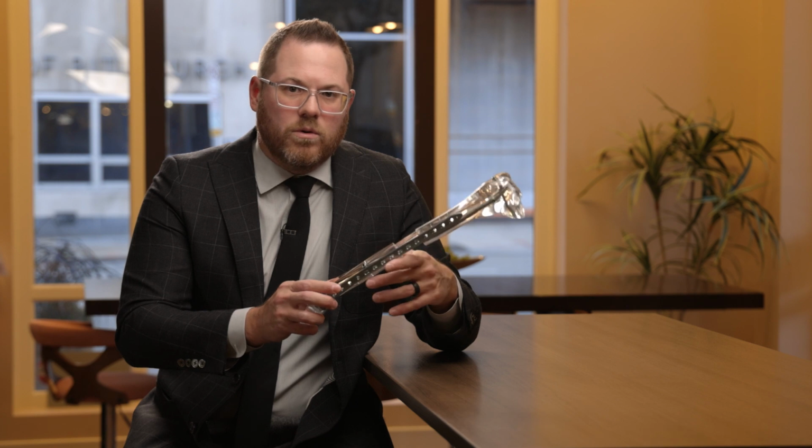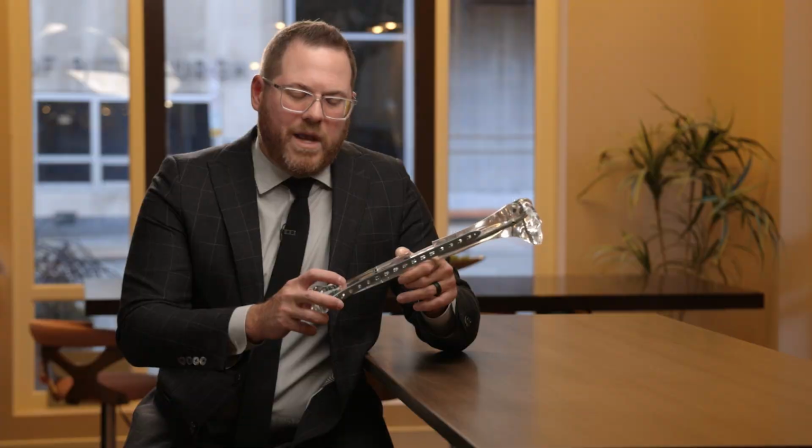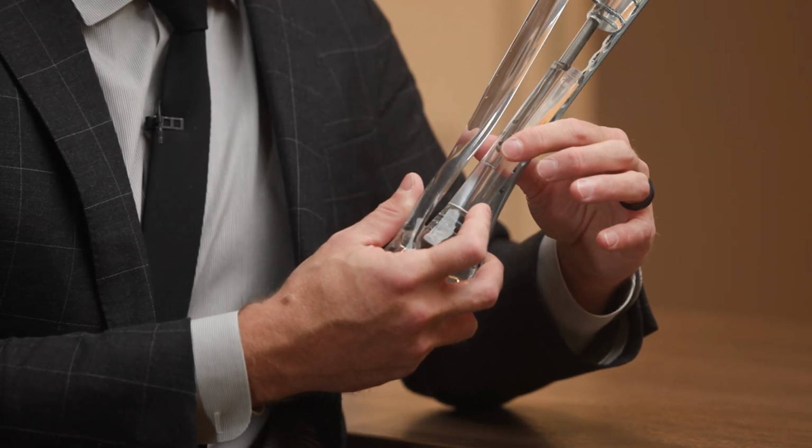That single screw will not prevent additional compression from occurring, but will help maintain the position of the transport segment with the distal segment.